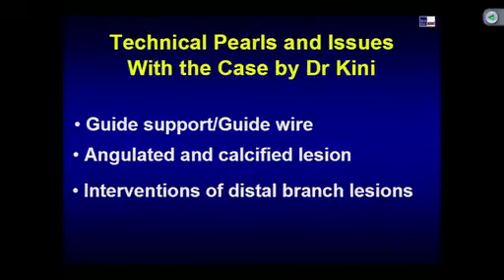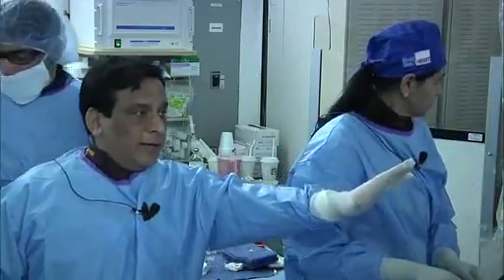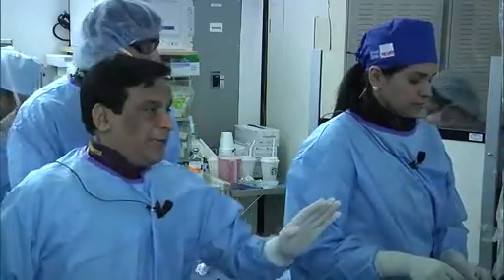And the last point was that how do we take care of this bifurcation disease. Always the goal is take care of one important branch, and here I think we will focus on the PDA, the other one we just going to do PTCA. So, that branch will remain open. Good, very good. Now, I think if we can go back to this fluoro again and little bit of discrepancy.